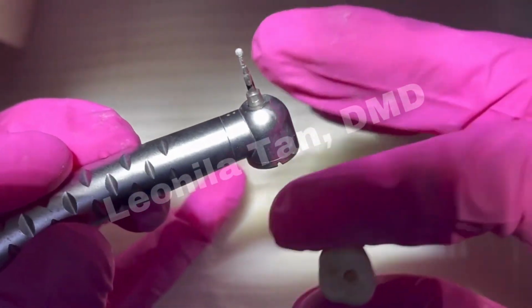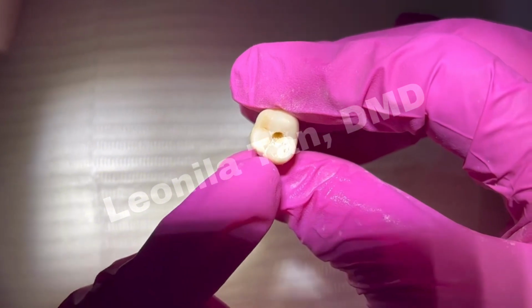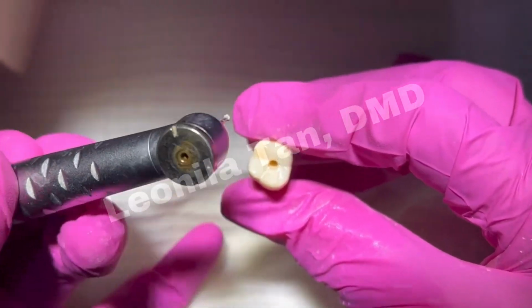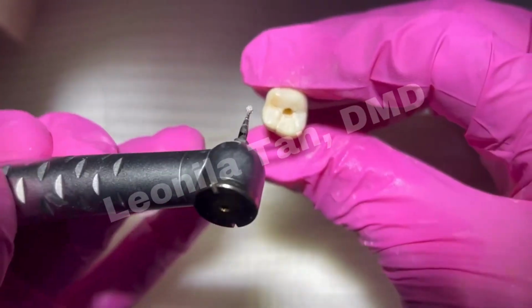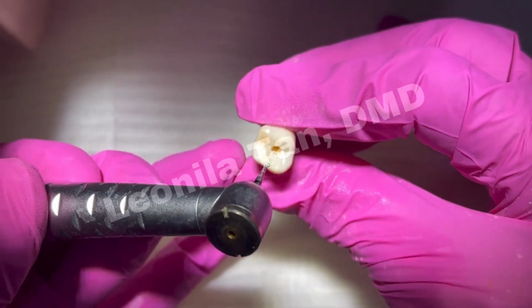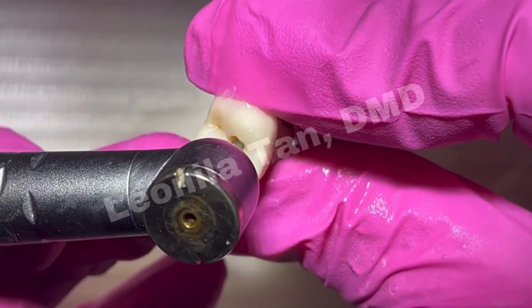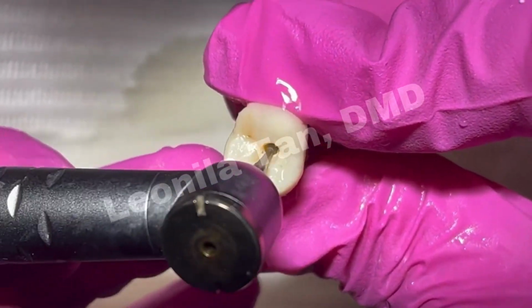Still using the same burr, since we already located the entry into the chamber, or the drop, now you start to unroof. The same sequence: that round burr that you used initially, you direct it towards the area where you went in, and you pull going out.